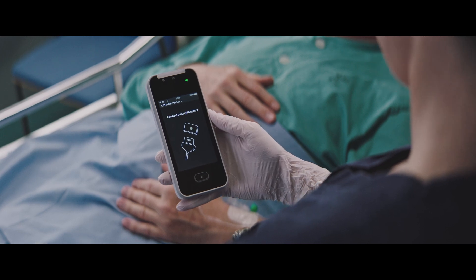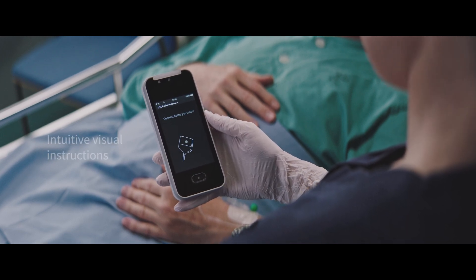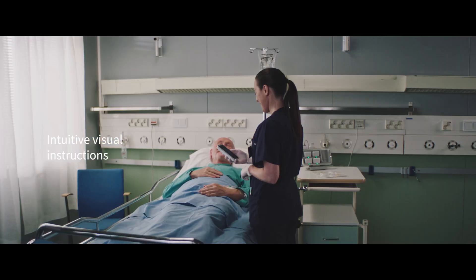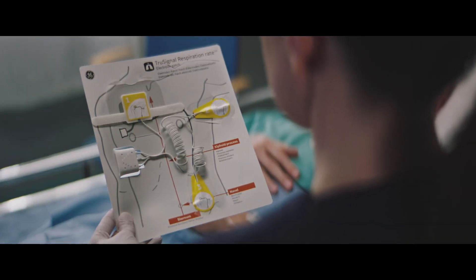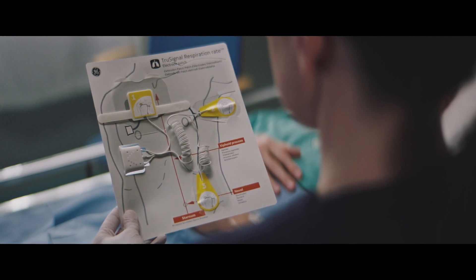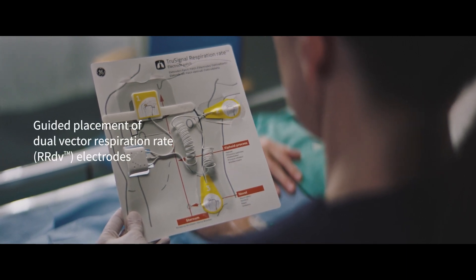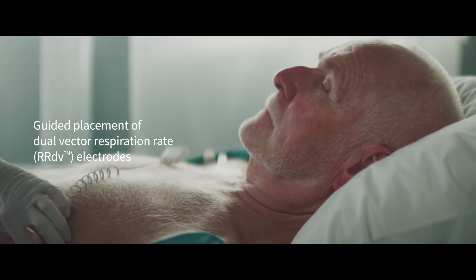Once the patient is selected, the nurse then follows the on-screen visual instructions to associate a sensor with the monitor. First, the nurse would place the wearable respiration rate electrode patch on the patient. The packaging contains detailed graphics for optimal patch placement.